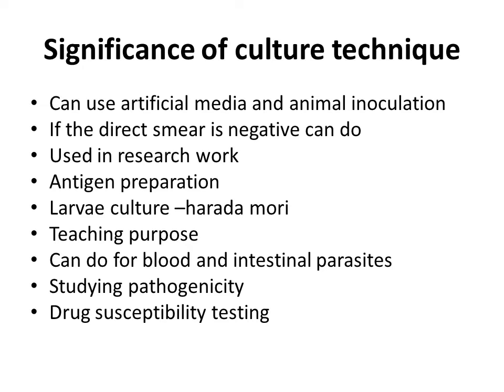Even if a specimen contains a single parasitical stage, by using the culture technique we can magnify it, that means we are growing the parasite. If we see only one parasite, it will grow in the culture media, and we can identify it further.